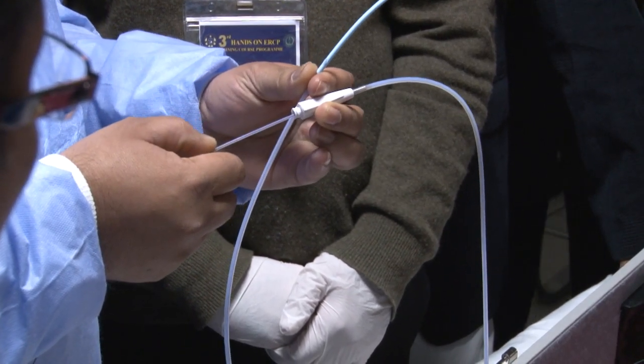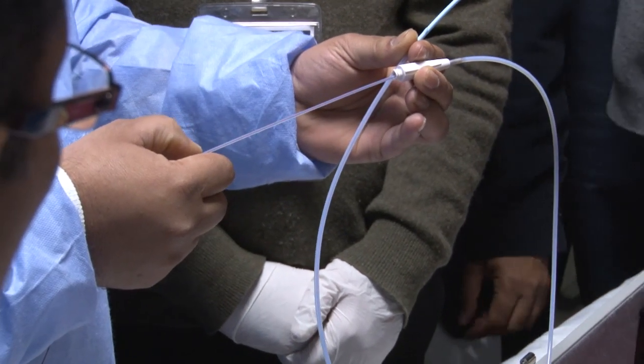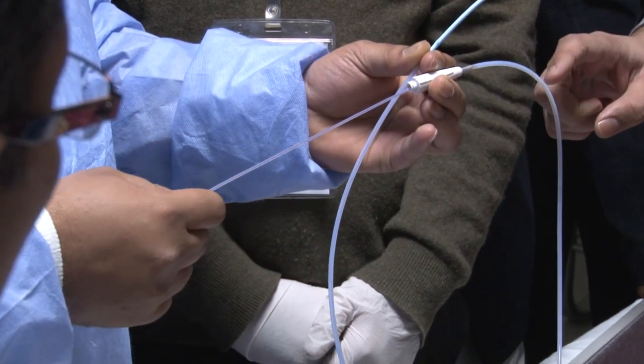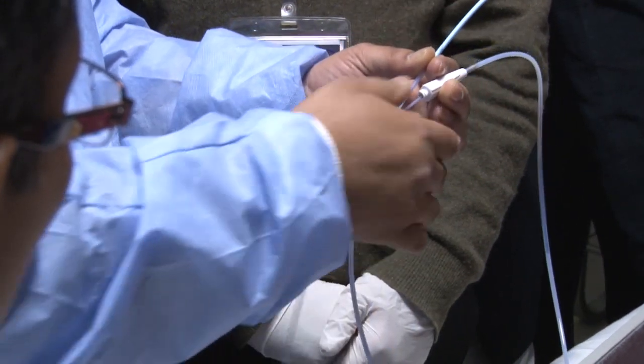Yes. You're railroading the stent over a guiding catheter. That's why it's called guiding catheter. Okay, after crossing, we pull back the guiding catheter and withdraw it, and our stent will be placed there.